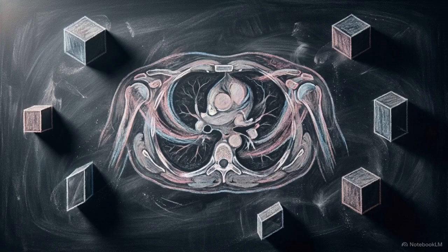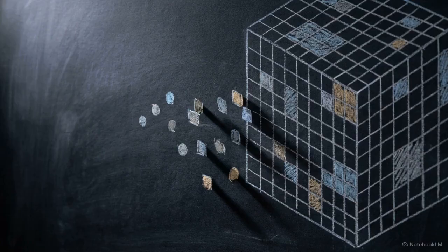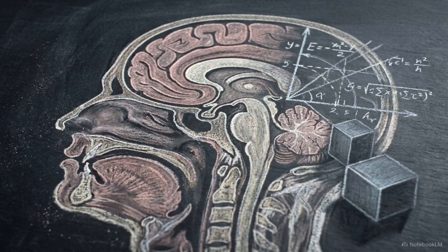Phase wrap, or aliasing, occurs when the patient's anatomy extends beyond the prescribed field of view during phase encoding. The scanner undersamples the signal coming from outside the boundary. Mathematically unable to process this isolated data, it folds or wraps the anatomy back onto the opposite side of the image.